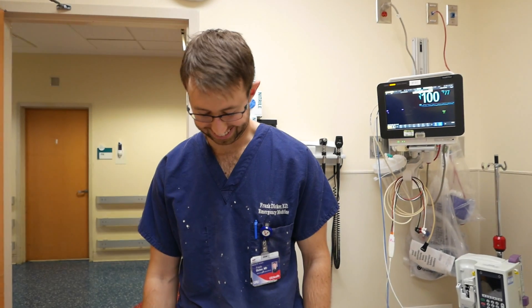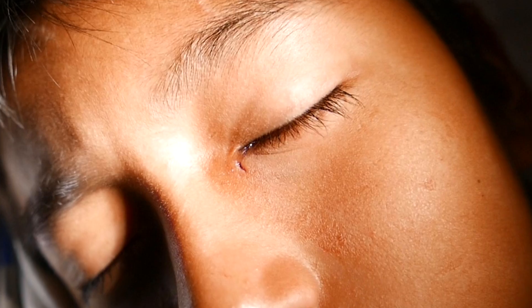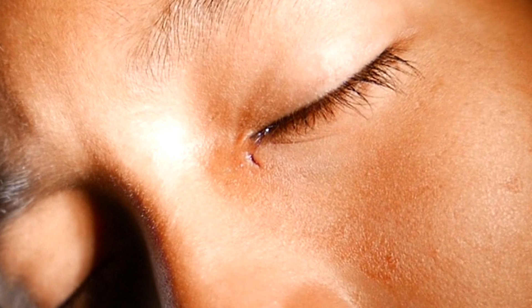Frank, you're all covered with plaster from putting a splint on, but can you describe what we did here today? The patient had a small metallic foreign body medial to the eye — just medial to the canthus, as you can see right here. It was visualized on x-ray, however we could barely see it on exam.